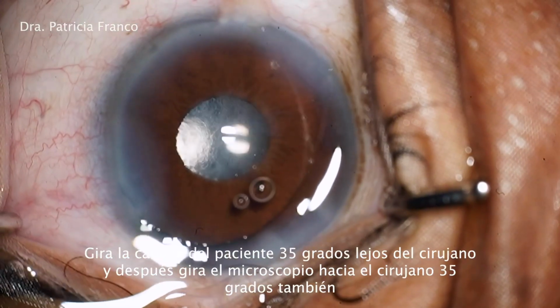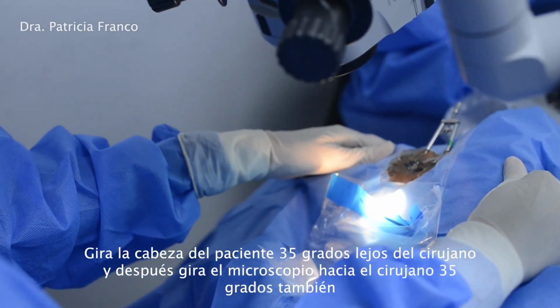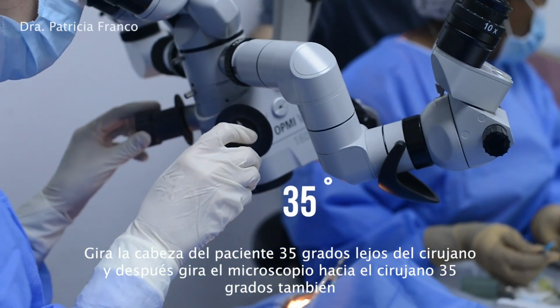To start with the goniotomy, turn the head of the patient away from the surgeon 35 degrees, and then turn the microscope towards the surgeon 35 degrees also.